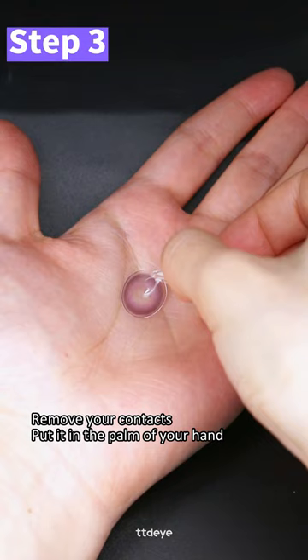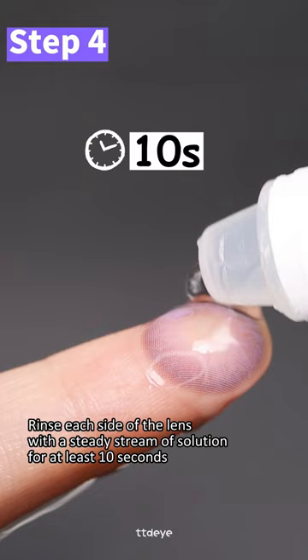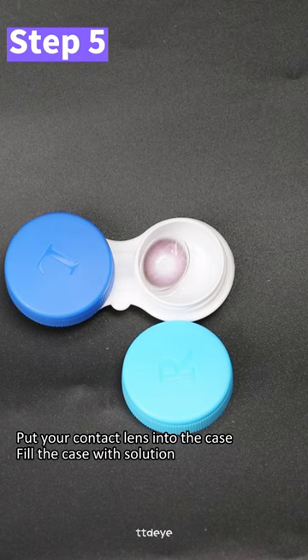Rinse each side of the lens with a steady stream of solution for at least 10 seconds. Put your contact lens into the case and fill the case with the solution. Make sure the lens is completely submerged in the solution.